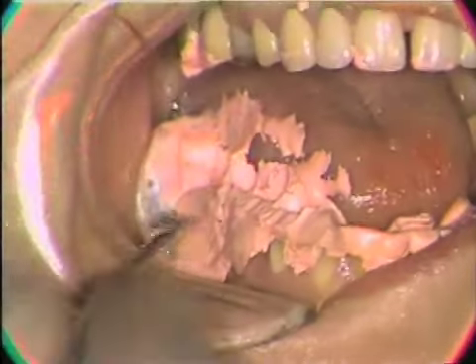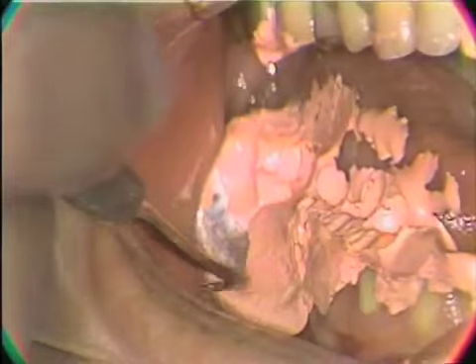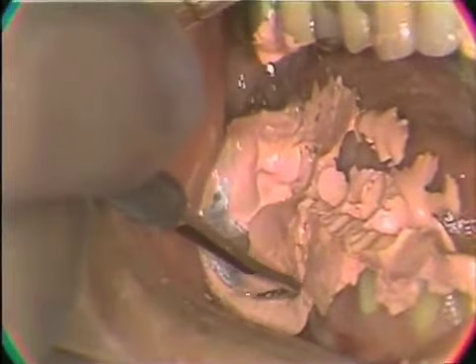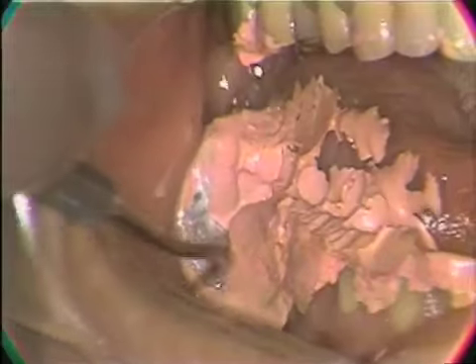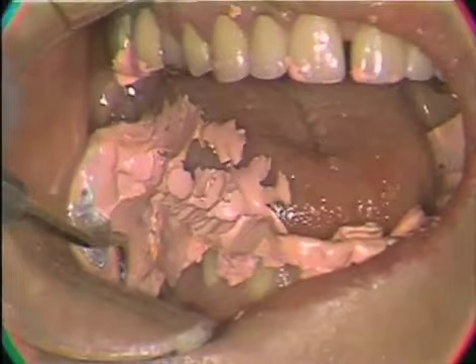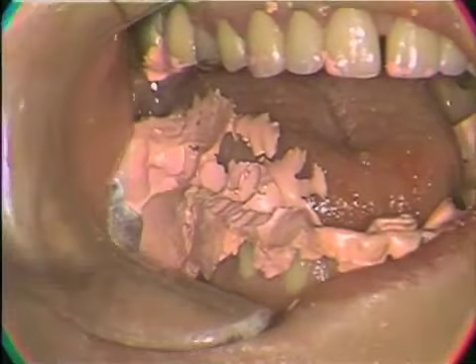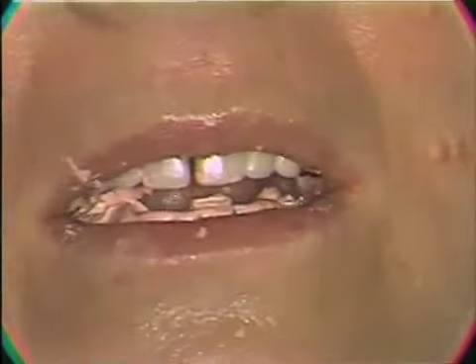Roll over to the other side, please. We look at the other side. Back along the tray, it looks like we've got a good roll right along the edge. It doesn't look like there's much material there, but we still have a good peripheral roll along the edge of that area. If there was a void there and you wanted to correct it, you would mix at this time, add it to there, let it set up before you take the tray out. We can now go ahead and take this tray out of the mouth, or the impression out of the mouth.